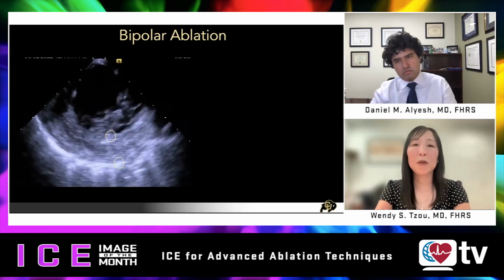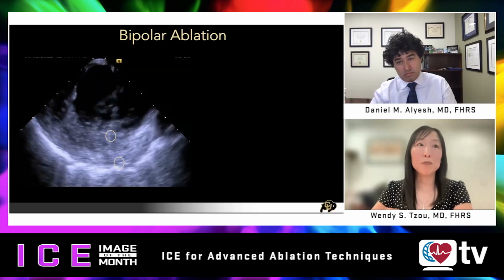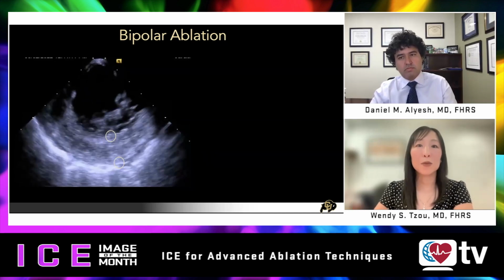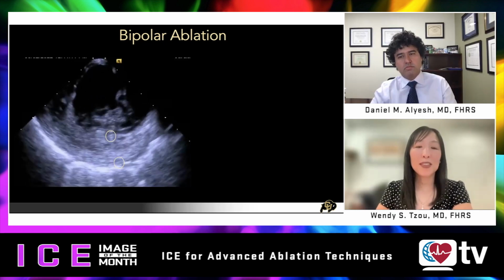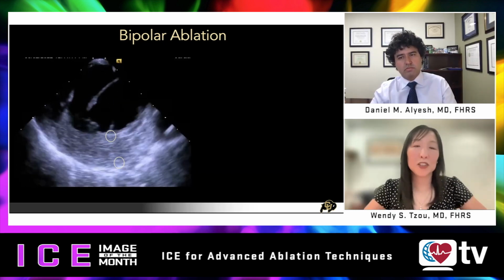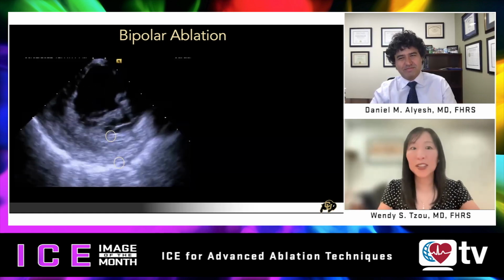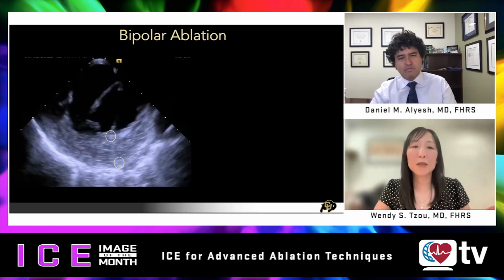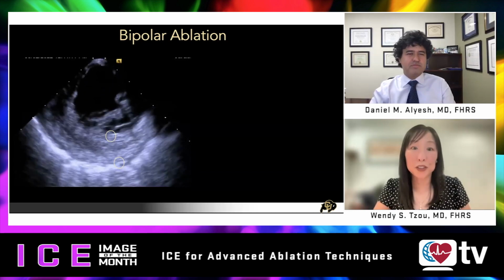In many cases, when we're talking about bipolar, it's on the septum. And then you're trying to negotiate holding both catheters steady, and you can only really reliably see one. Sometimes you can see two if you jerry-rig the system in a way that doesn't completely deconstruct cables. Then you're stuck looking on ICE, even with all of the above, or the scenario where you can see both catheters at the same time. You often are checking fluoro just to be sure, because you just never know.